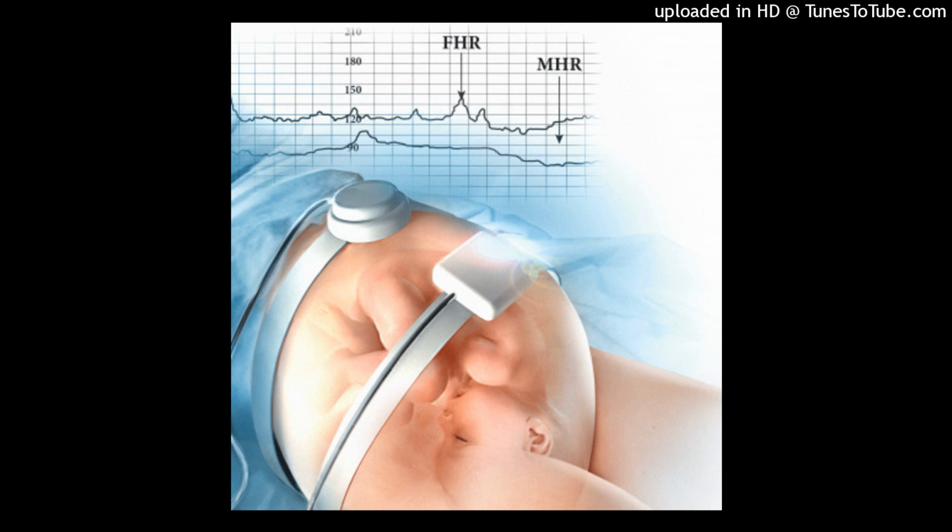During the 10-minute period of observation, there must be at least 2 minutes of identifiable baseline segments that do not need to be contiguous. If a 2-minute period is uninterpretable, the FHR baseline is considered indeterminate. The previous 10-minute period may need to be reviewed to establish a baseline.